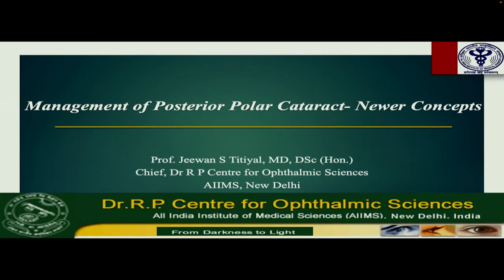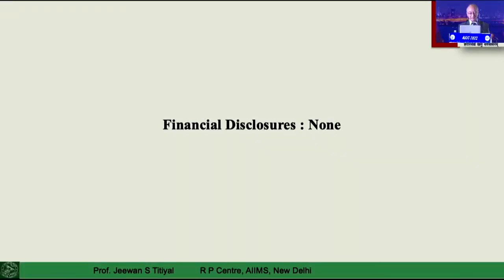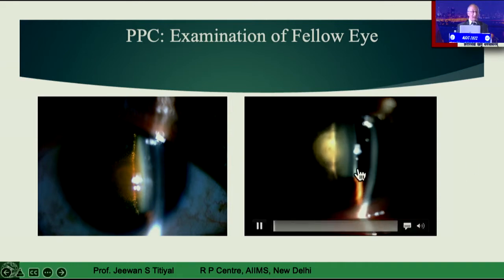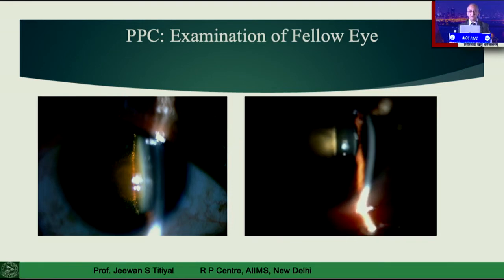Good afternoon, friends. In continuation of previous sessions also, the talks are repeated so that people take away some important tips and different areas. Posterior polar cataract, you all know, is challenging sometimes. And we talked about surgeries, but it's very important to assess your patients carefully and examine them in terms of integrity of posterior capsule.